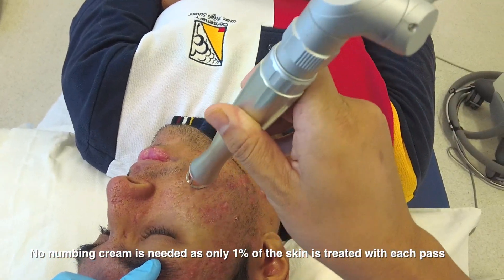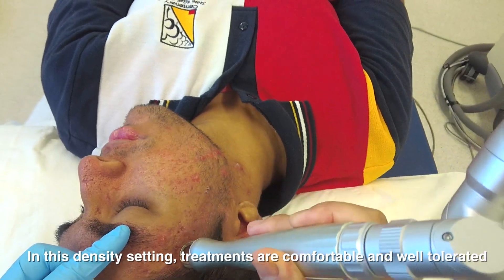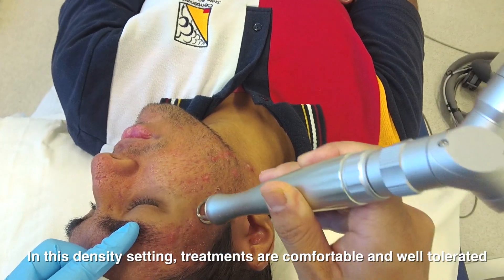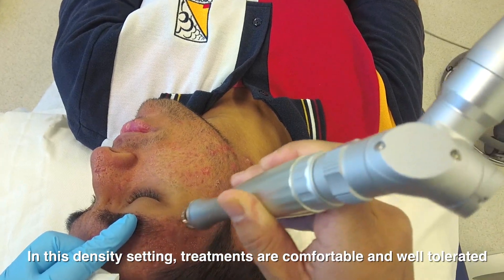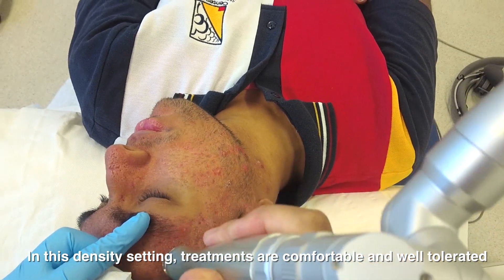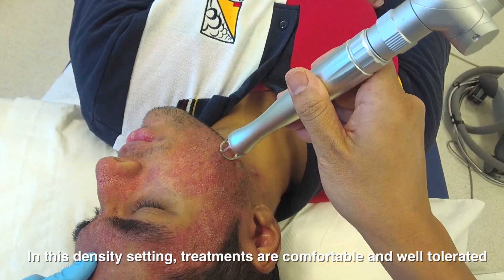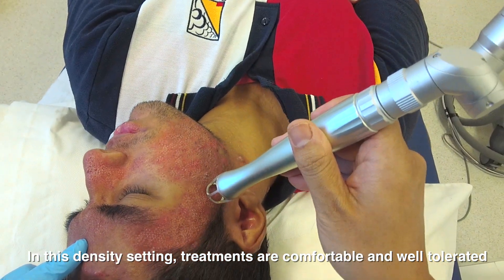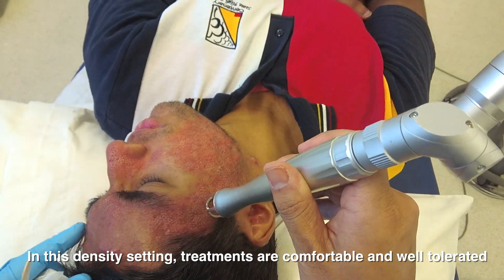This is what you're feeling. It's not too bad, is it? No, it's all right. So if you keep moving really, really quickly, you can see that the procedure itself is quite tolerable for the patient. Just pinching — it's like pinching, exactly. Nearly done. Okay, done.